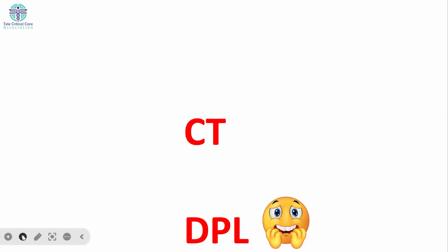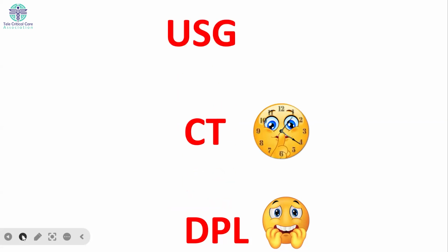So thank you, sir. So this CT scan was done, but because we have to shift the unstable patient to CT scan, which was risky, again there was a need for some other modality which can be used at the bedside. So here comes the superhero, sonography. Sonography is an excellent tool because all the advantages of DPL and CT scan are combined in sonography and the disadvantages can be avoided.